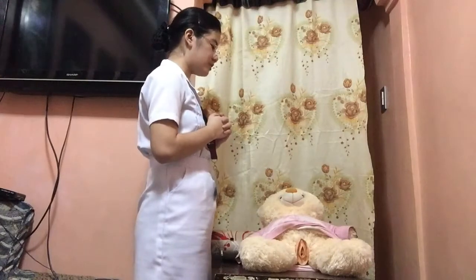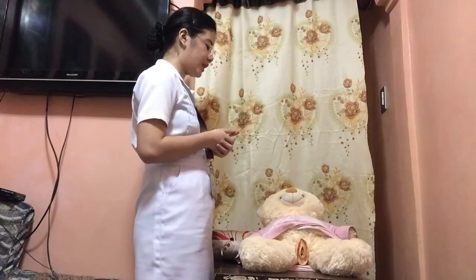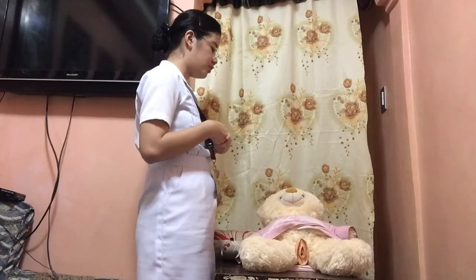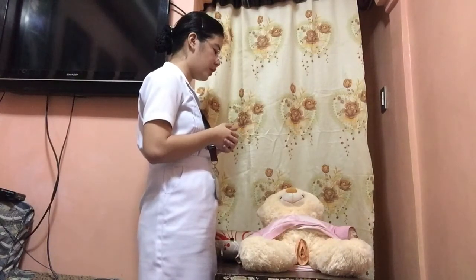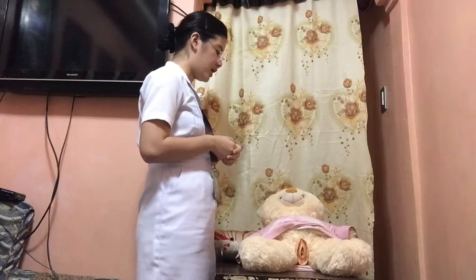Hi ma'am, I'm Maris Aikia, a student nurse from Perlop State University. The procedure we are going to do is catheterization. The purpose of this is to promote urine drainage. Do you have any allergies to iodine and latex?